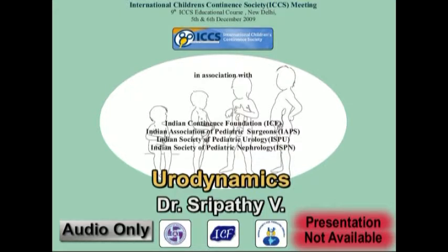So in conclusion, Uroflow is the most basic and easily done urodynamic test. It's easily interpreted if the ICCS criteria are remembered and appropriately applied. And in conjunction with ultrasound, it indicates when invasive studies are warranted.